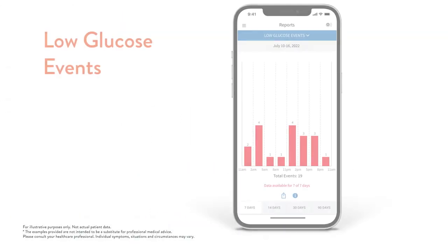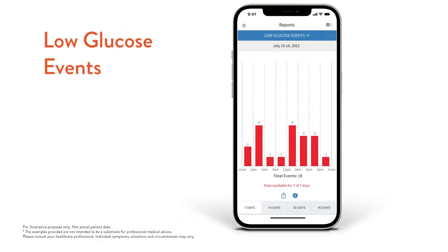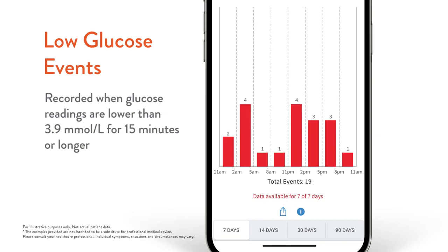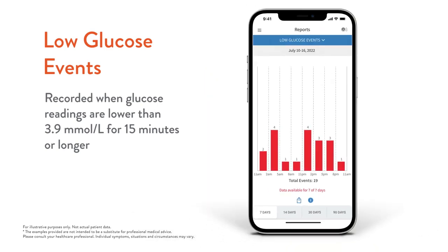The low glucose events report tells you when you have experienced a low glucose event. Looking at the last seven days, the Freestyle Libre 2 system will record a low glucose event when your glucose readings are low for longer than 15 minutes. Your total number of low glucose events are displayed in the graph, and the bar graph tells you what time of day they're occurring.